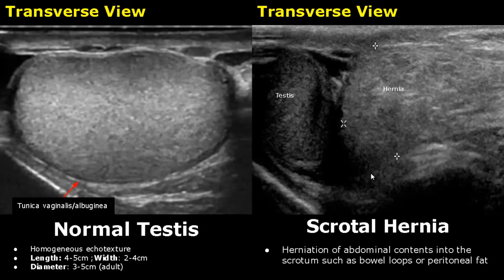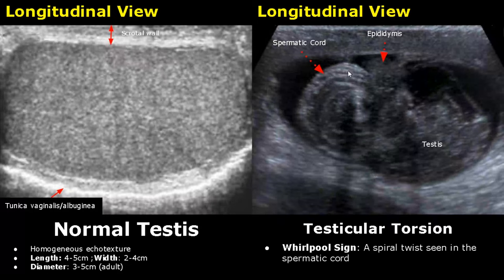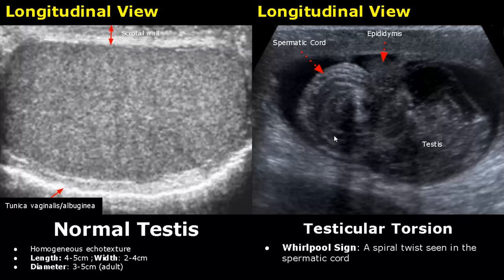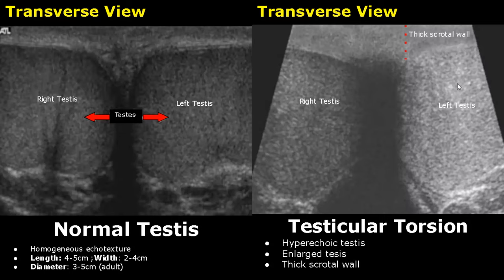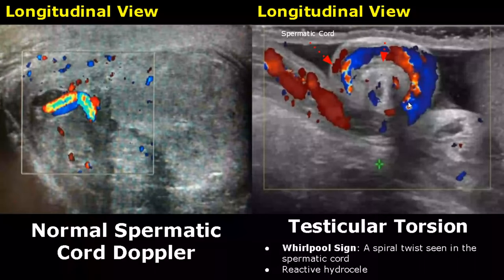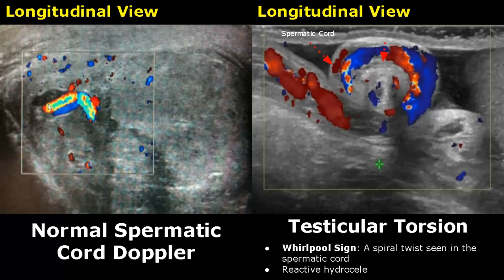In testicular torsion there is twisting of the spermatic cord which can cut off blood supply to the testis. One classic sign on ultrasound is the whirlpool sign — it appears as a spiral twist in the spermatic cord with alternating hyperechoic and hypoechoic rings. In this transverse view showing both testes, there is torsion of the left testis — it is hyperechoic and larger than the normal right testis, with scrotal wall thickening. Here we have the whirlpool sign, seen better with color Doppler compared to the normal spermatic cord flow. There is also a hydrocele caused by the torsion.